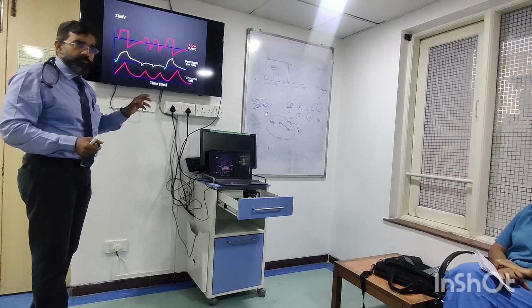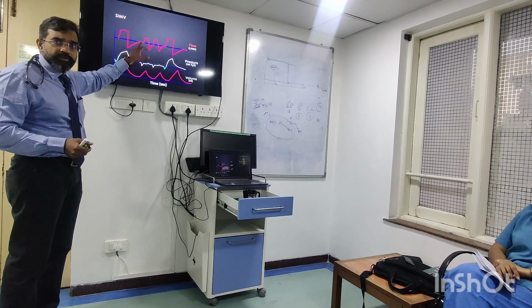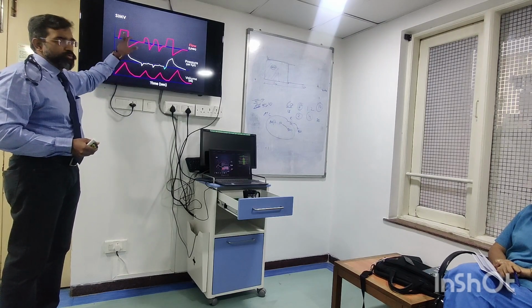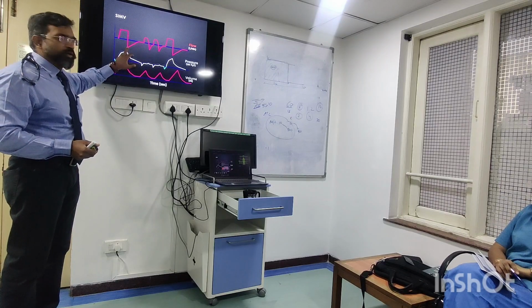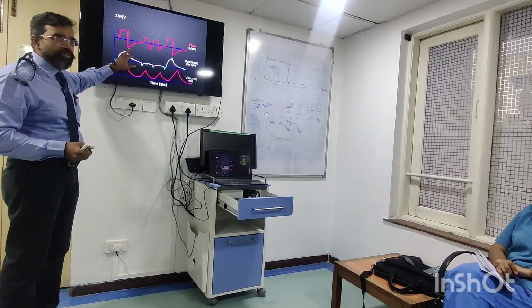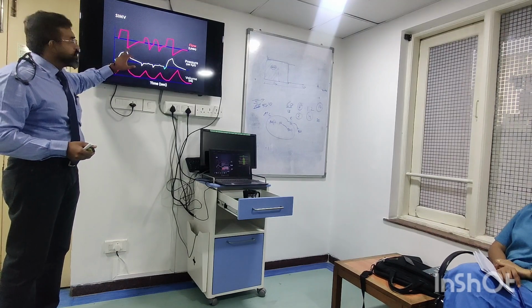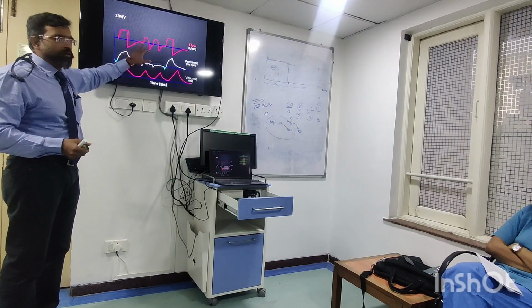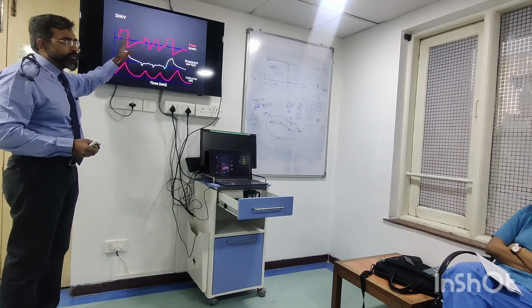Clear? Inspiratory flow. Expiratory flow. This is not the ventilator. This is our patient. So whatever patient-related problem there is will be seen here, and nothing will be seen here. That is why when we want to monitor peak expiratory flow rate, I'm going to look here, and as I'm nebulizing my patient and I want to see improvement, my peak expiratory flow rate will change. You understand? Clear on this? Similarly, if my patient is having extreme bronchospasm, I'll see this to be prolonged. I don't see any changes in this. I'll see changes in this, in the flow waveform. Is it making sense? Because this period is the patient period, right?